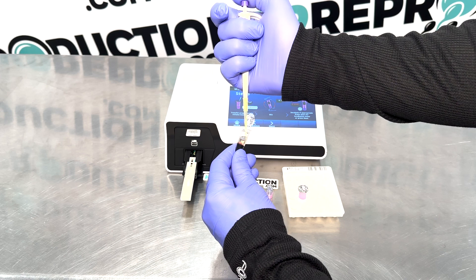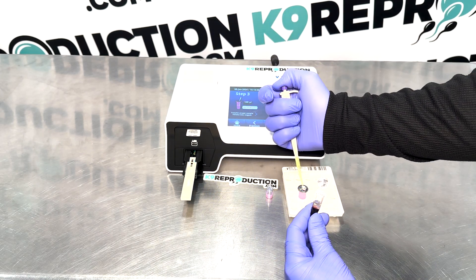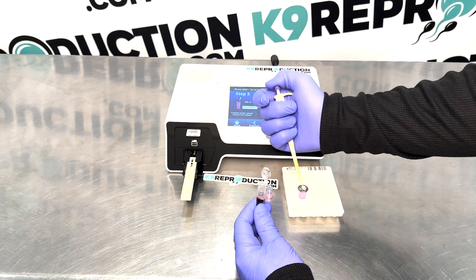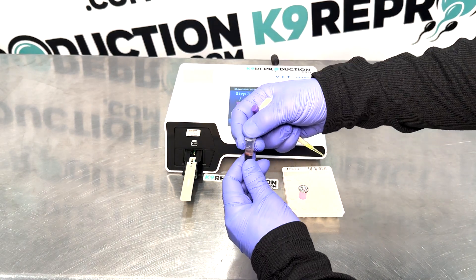When you're pipetting, ensure that the button is only depressed to the first stop when drawing fluid up into the pipette tip. We only depress the pipette button down all the way to the final stop when we're clearing the pipette tip out.